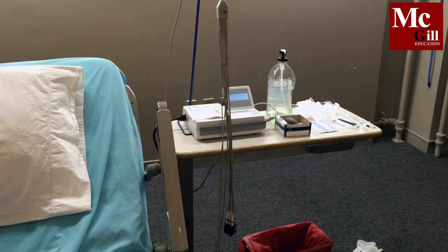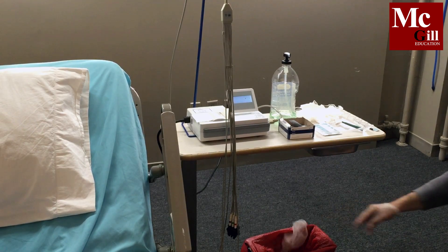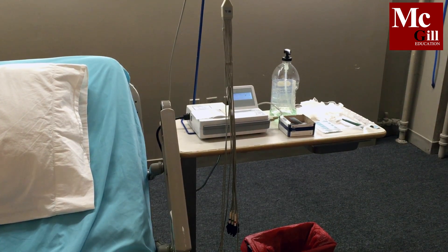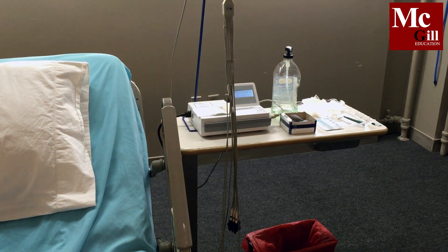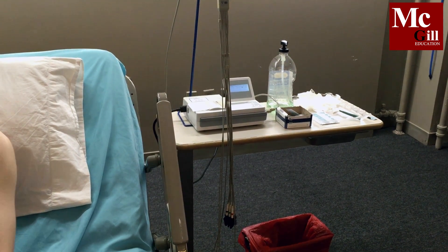You must also identify the patient. May I have your name and date of birth, please? My name is John Smith. I was born February 10, 1991. Make sure you explain the procedure to the patient and position the patient comfortably.